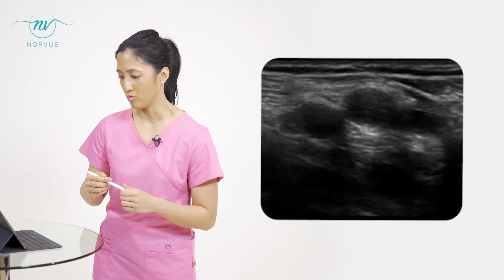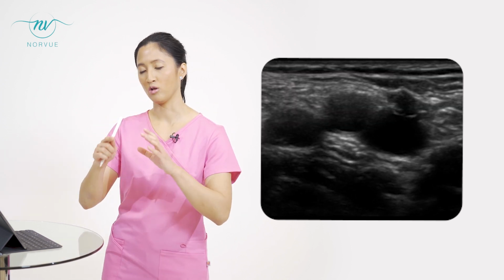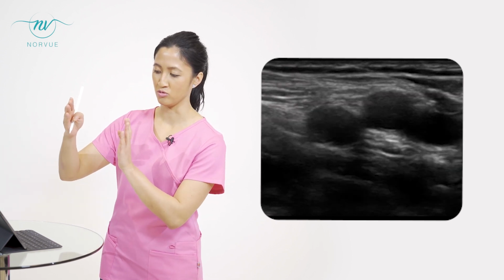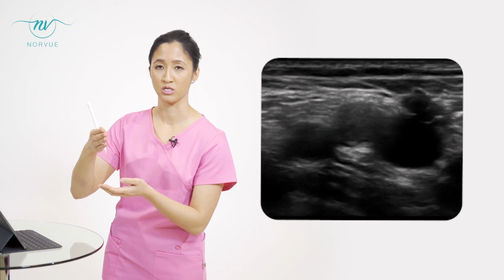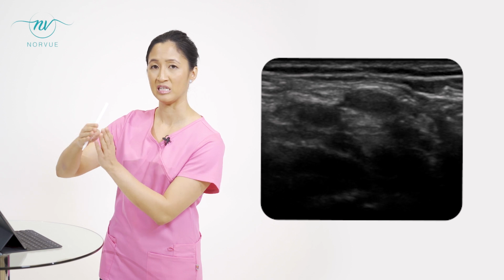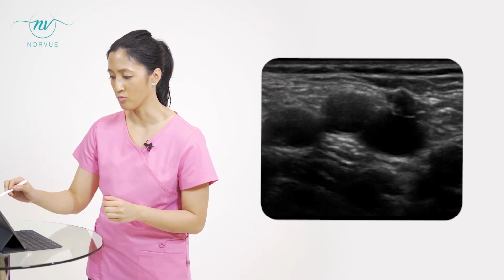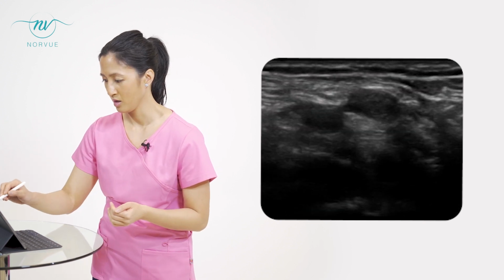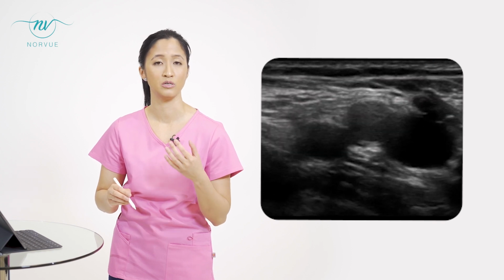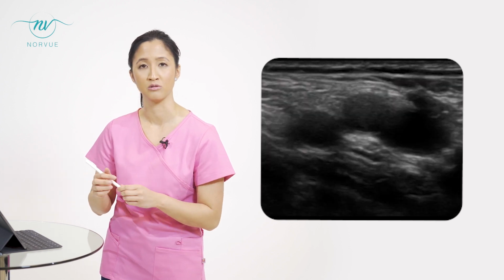And as you can see, here we put some compression on the blood vessels. Because the wall thickness is really thin for veins, when you do a compression with the ultrasound probe, it will make the walls of the vein meet each other like this. And this is normal for a vein. This compression is really important when you do the ultrasound examination for deep venous thrombosis, because if there's a blood clot there, the vein won't compress, and you won't see the walls meet on the ultrasound screen.